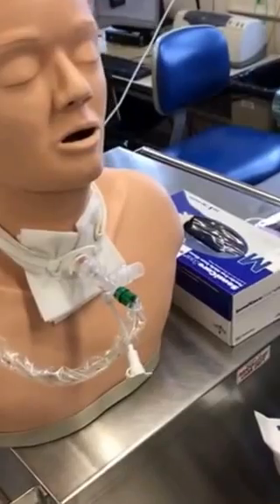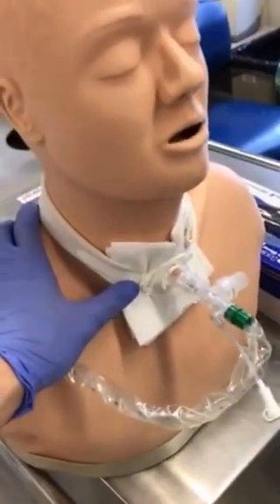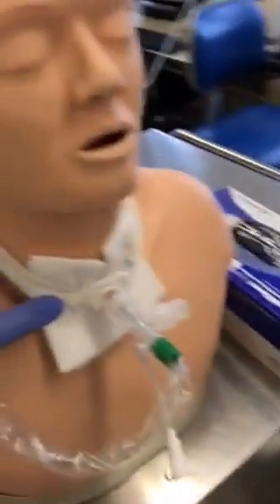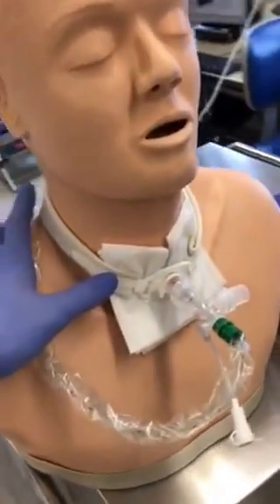So, just giving you a little brief background, this is my patient here who has a trach. He has a C1, C2 ASIA A fracture, and this is our cough assist machine here. So we're going to teach you a little bit about hyperinflation today, cough assist, and you'll learn a little bit more about spinal cord injuries.